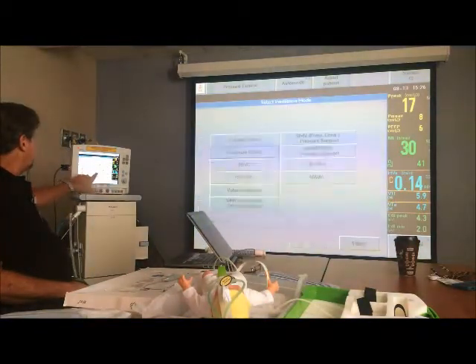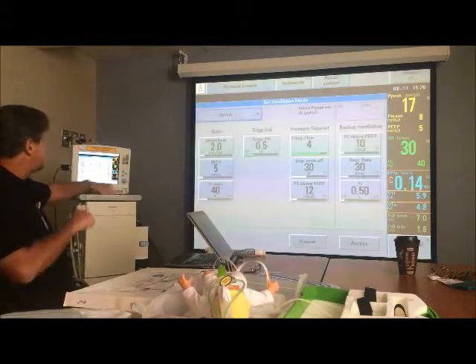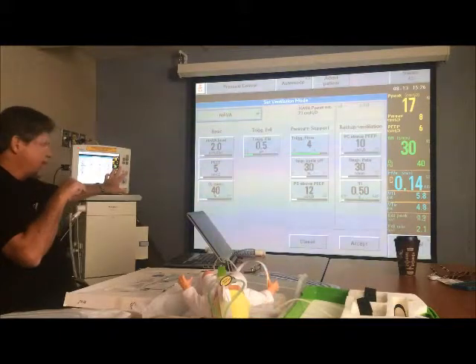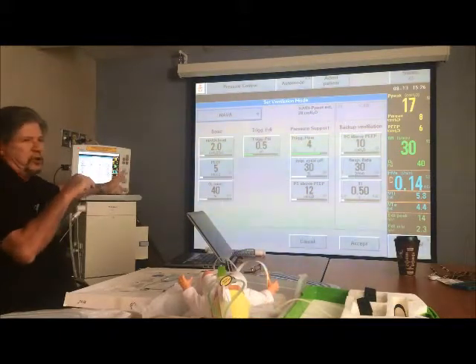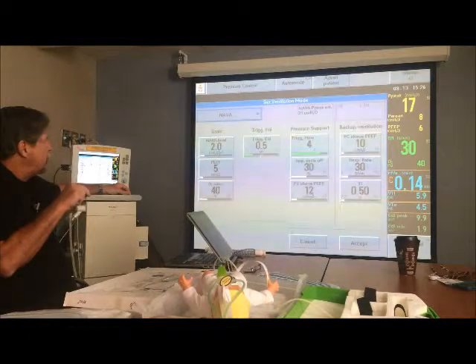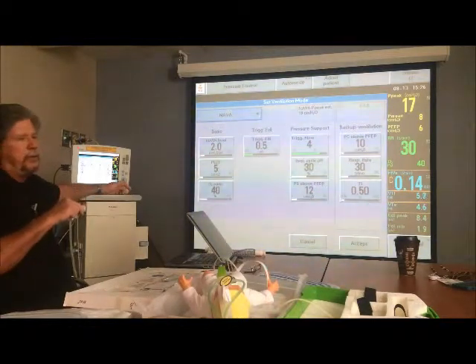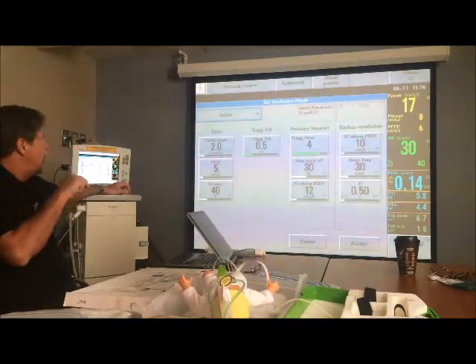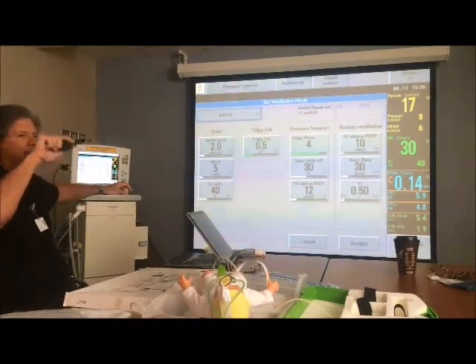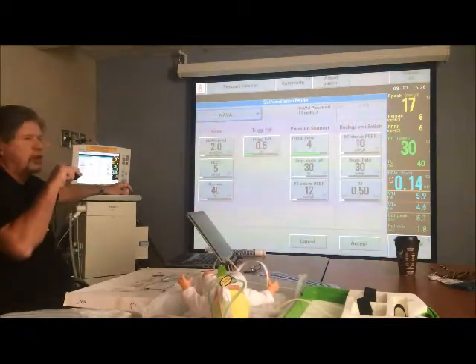And we'll go here to the mode, NAVA. And so here, there's the NAVA level that we locked in. The peak is going to carry over, and the FiO2. Remember, it's a spontaneous mode, so there's no rate or anything. And here's that trigger threshold that I told you about. And it's an electrical trigger. So on any particular breath, let's say the EDI minimum is 0, for argument's sake. When the EDI begins to climb up, when it gets to 0.5 microvolts, the ventilator begins to multiply this number by this number as it begins to climb up. Okay? So this is the trigger threshold.